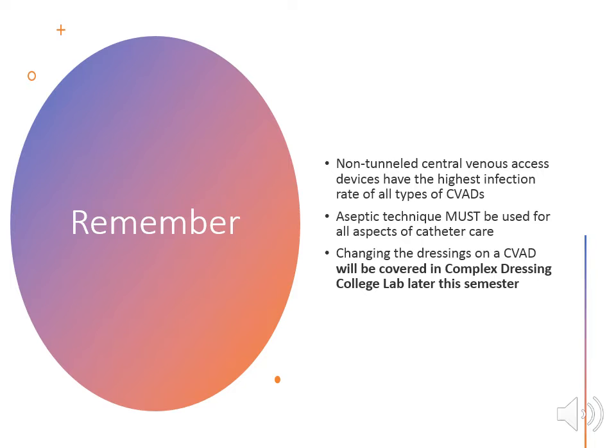You want to remember, non-tunneled central venous access devices have the highest rate of infection of all types. Aseptic technique must be used. Changing the dressing of a central venous access device will be covered in the complex dressing college lab that's going to be later on in the semester.